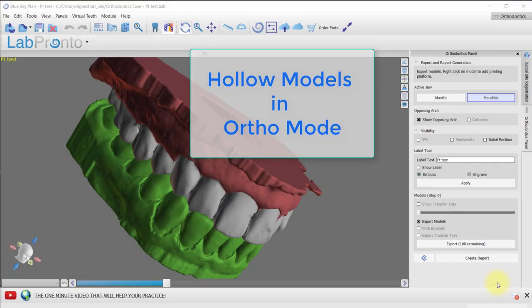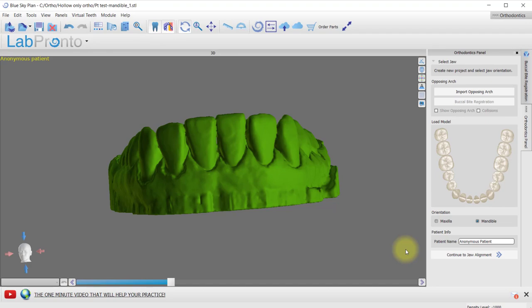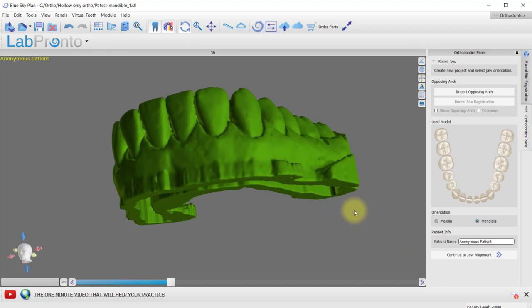Blue Sky Plan Ortho can now generate hollow models automatically when you export models from the program. Here is an example of a hollowed model.